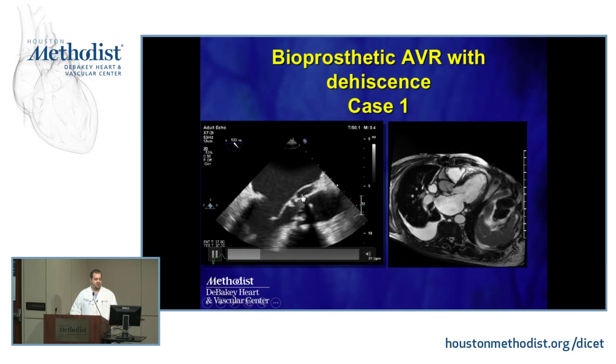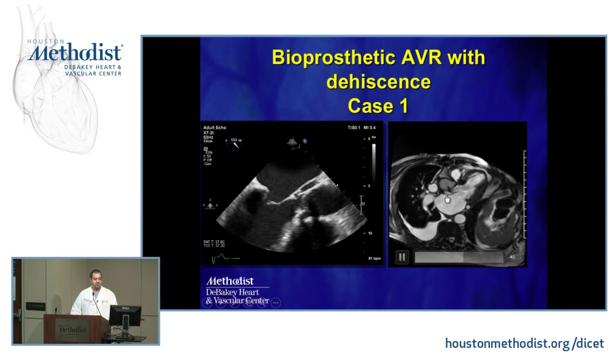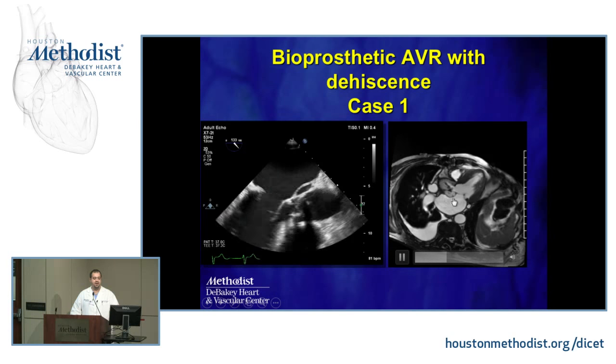This is a case I think Dr. Little showed where you have the pseudoaneurysm and you got this communication creating almost a fistulous tract between the LVOT and the ascending aorta. You can see that also in any other anatomical imaging modality.